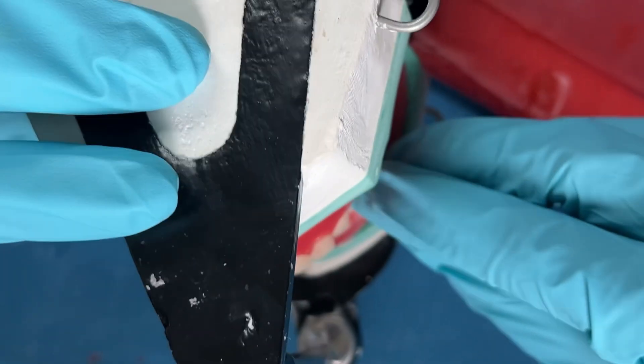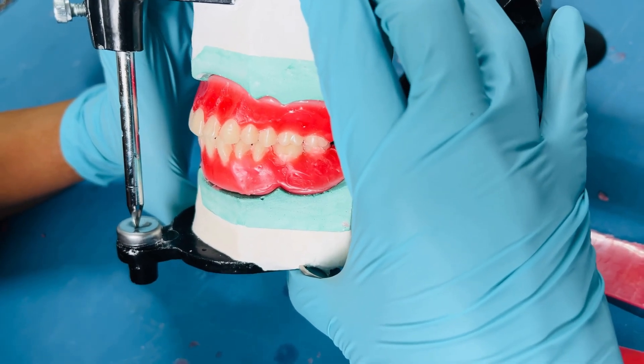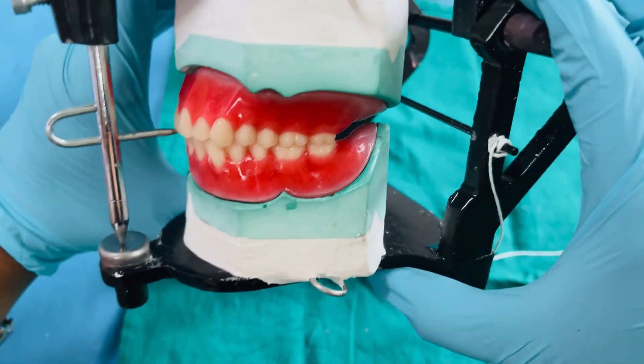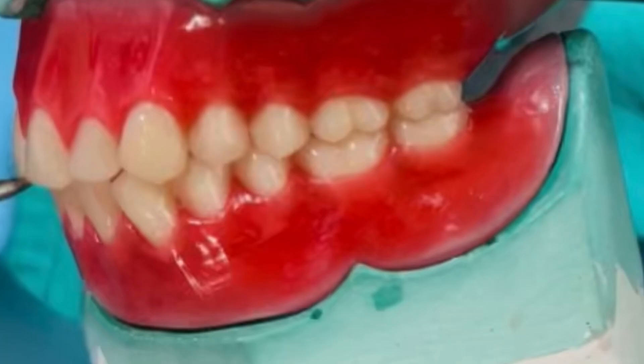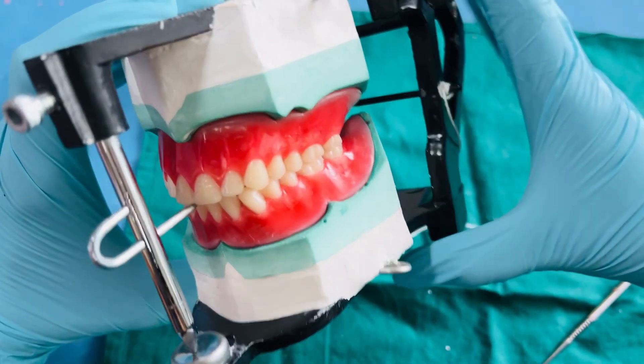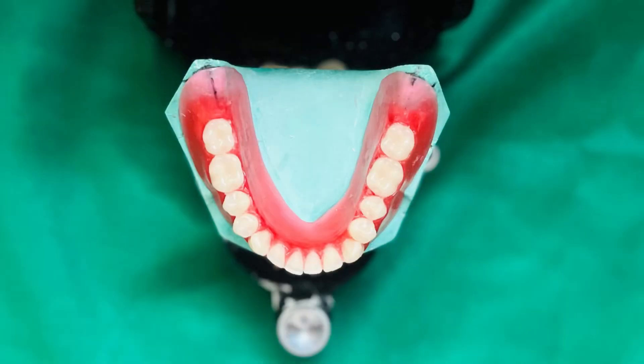After each mandibular tooth is placed, close the articulator and verify that the occlusion is correct. Also make sure the vertical pin touches the incisal table. Make sure the occlusion is tight both from the buccal and lingual aspect without any gaps. Complete the arrangement on the opposite side in a similar manner.